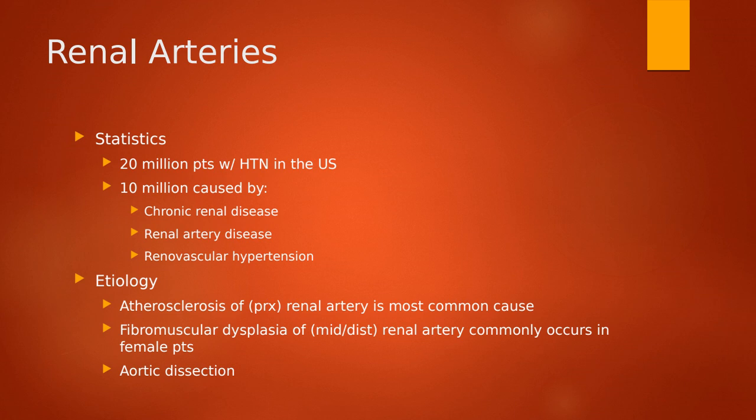Sometimes, for confusion's sake, I like to make sure that I call proximal renal artery the origin, right? Because that's where it's originating from. It's originating from the aorta. I call the mid region mid, and distal I call the hilar region. So they know I'm looking at the hilum of the kidney for that distal aspect. So we'll come back to that again in a second.